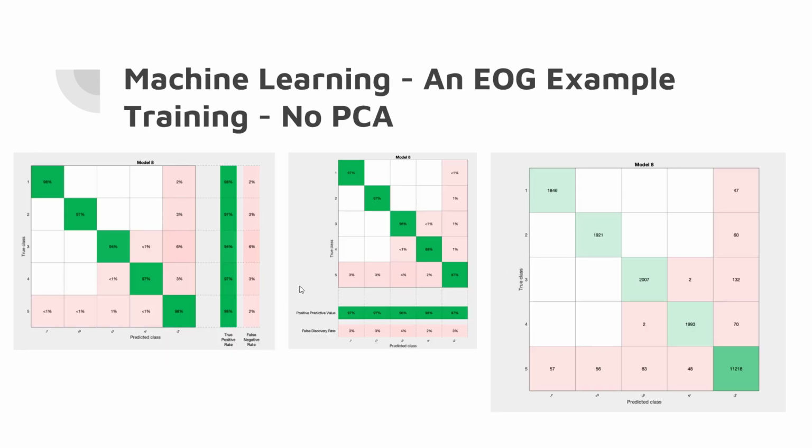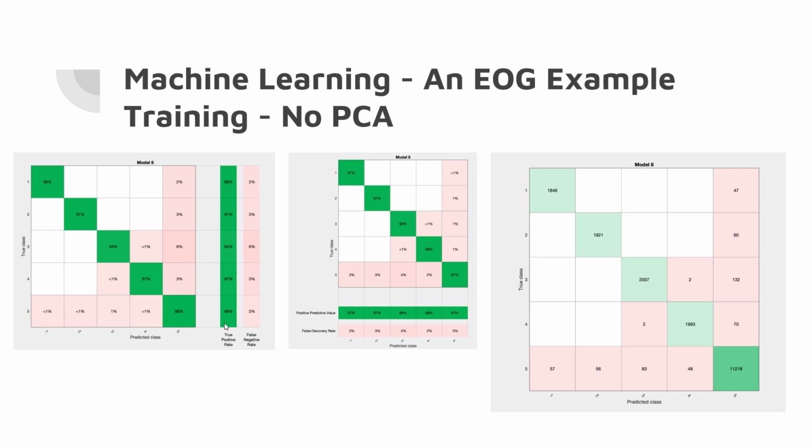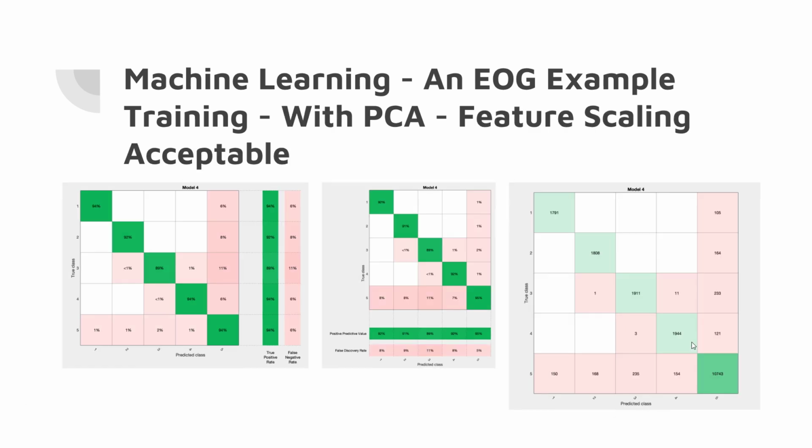And so this is an example of the accuracy I got from this algorithm, just to justify what I'm saying, to show you we can get on the order of 97%, 96%, even 98% accuracy when we're including reject classes to remove things that we consider artifacts.